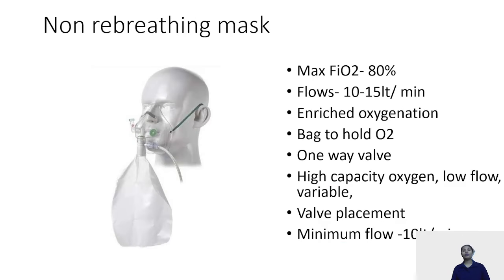Coming over to the non-rebreathing mask. See, we have two types of mask. One is the partial rebreathing mask and the other is the non-rebreathing mask.